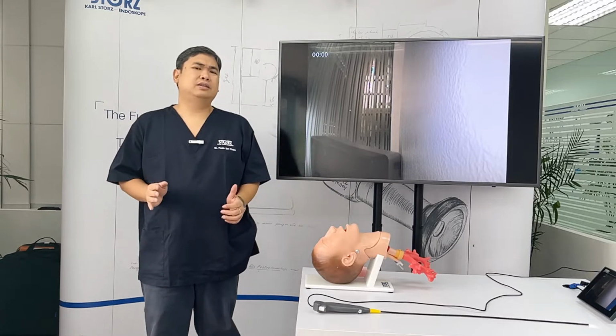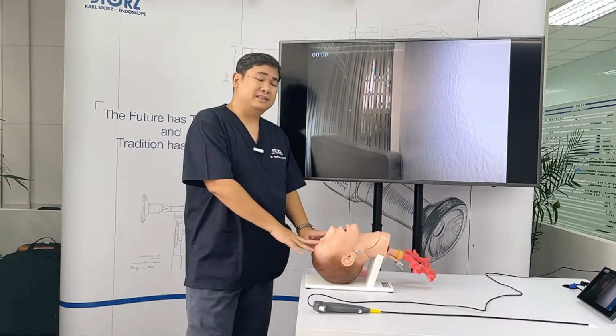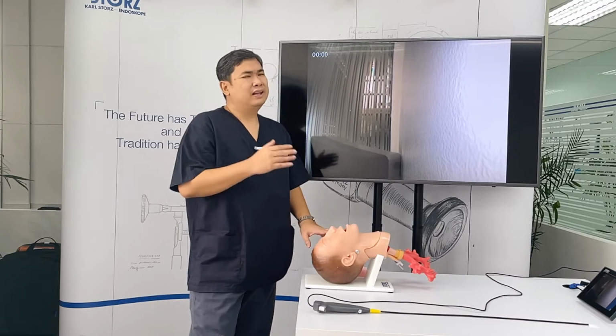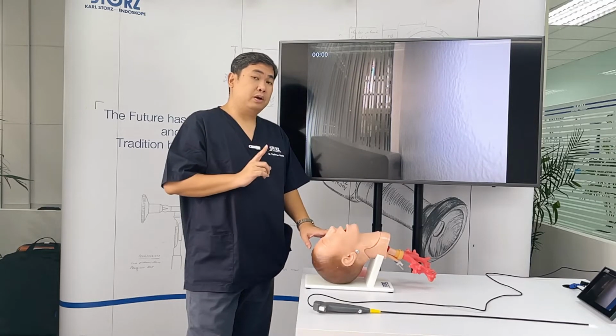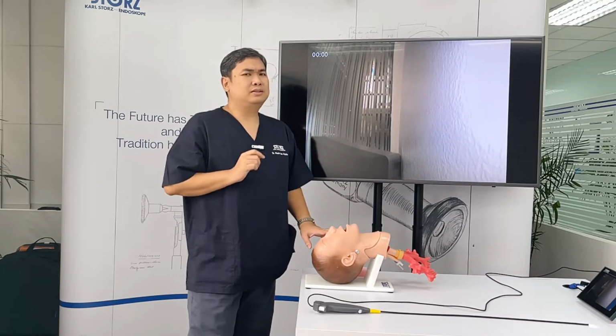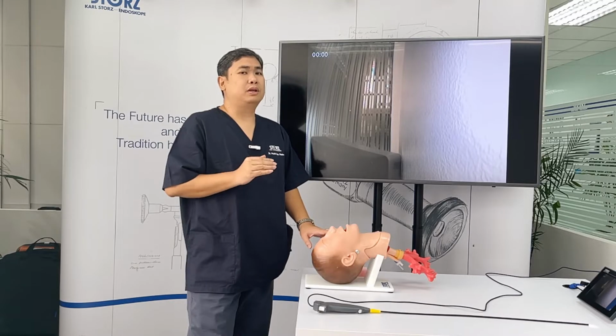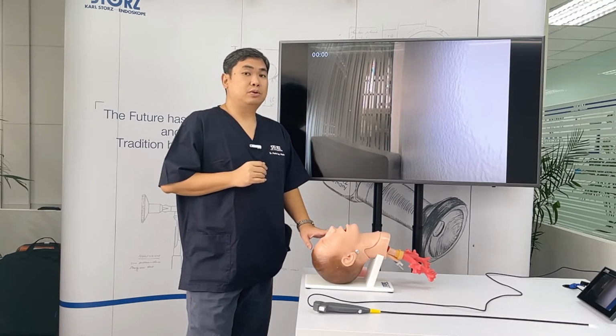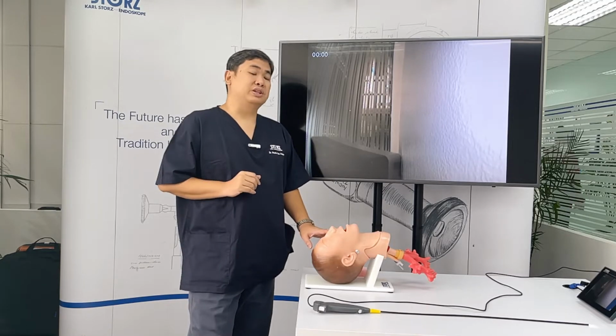A lot of us don't want to practice on mannequins because it's different from an actual patient. That is true. However, it is also true that practicing with a mannequin gives us the dexterity and muscle memory to perform better when we're performing flexible endoscopic intubation on an actual patient.